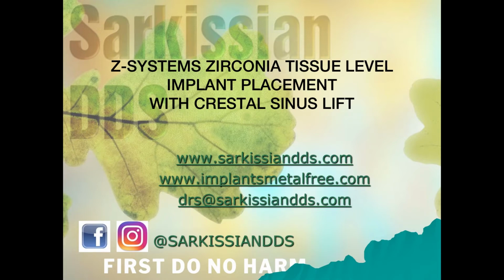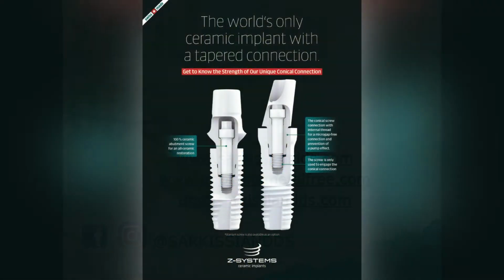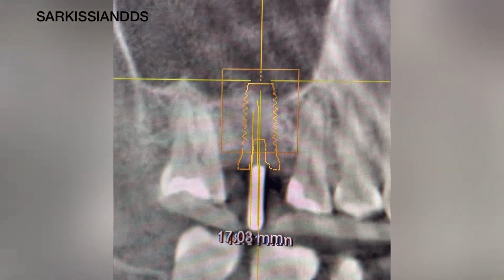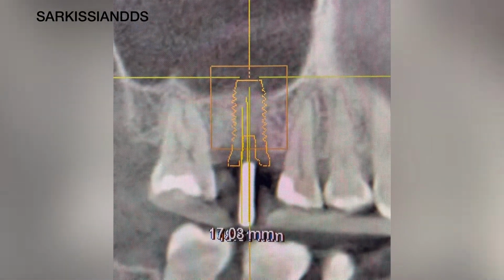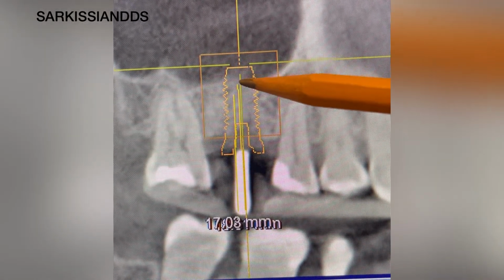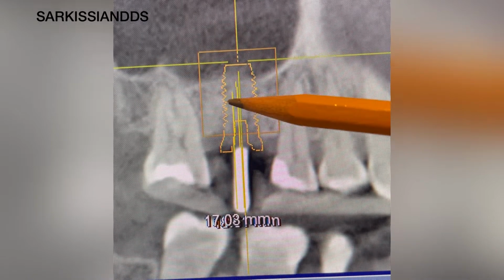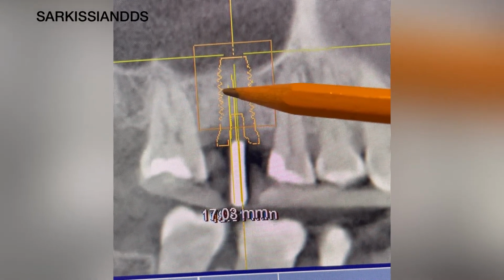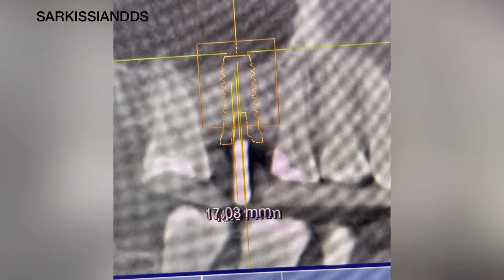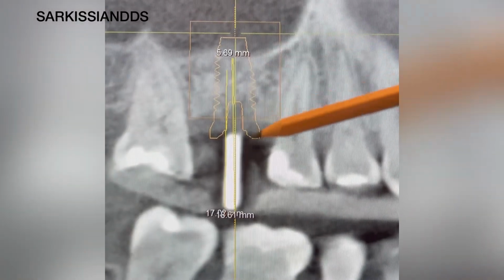In this video, I will be performing a crestal sinus lift and placing a Z-Systems tissue-level, fully metal-free ceramic zirconia implant. The cone beam study with the simulated 5 by 10 millimeter implant reveals that I need not more than maybe 3 millimeters of sinus lift, which is totally acceptable for a crestal approach.